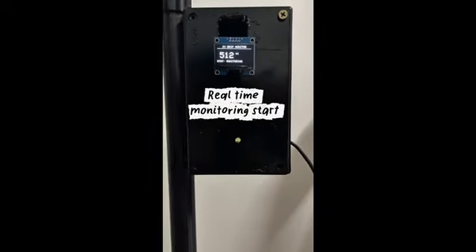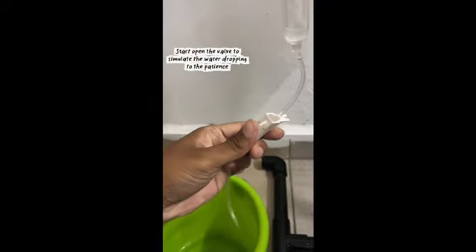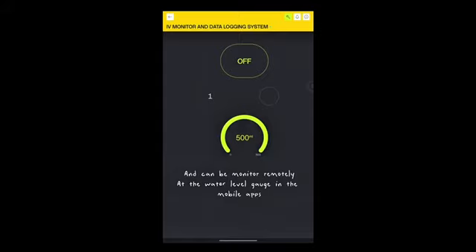After we install the new IV bag, we can see the real-time monitoring. It will display the amount of water in the bag. Then we open the valve to simulate the water dripping to the patient. The remaining IV water in the bag can be monitored in the display box. This IV drip process can also be monitored remotely at the water level gauge in the mobile app.